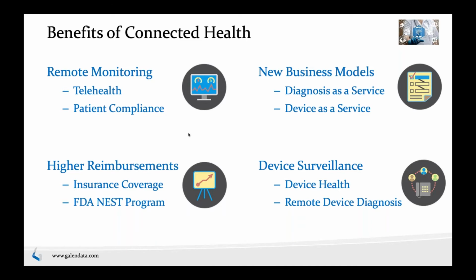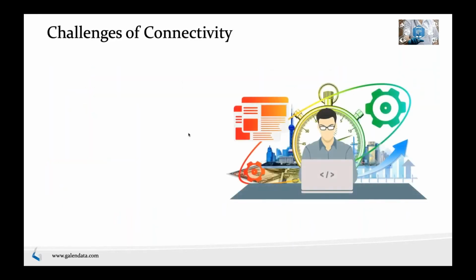Your quality team can capture some of that data that gives them context of what the complaint is about. Also, very important, if you have connectivity, you can do over-the-air updates to keep your device, your firmware, and your entire device fleet secure, and enhance the functionality out in the field as you go. So while we saw the benefits, everything comes with challenges.